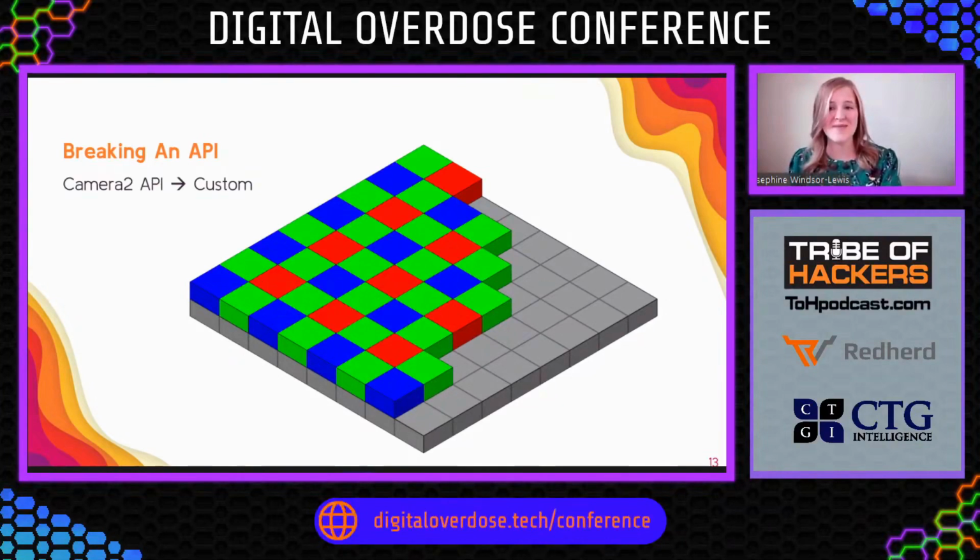There is no standardized format for raw sensor image data, and the format of these files can differ significantly between phone models. The differences include color filter arrangement, orientation, masked pixels, and many other characteristics. Luckily, they will come with a header, that's a few bytes at the beginning of the file, which gives you this information if you can decode it.